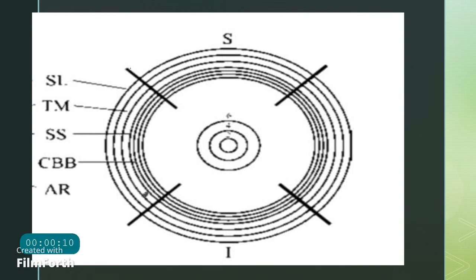So here, as you can see, these four lines represent the mirrors in which we are going to see the structure. As we know, the superior mirror is going to show the inferior angle, so whatever you see in the superior mirror, you have to represent in the inferior angle. Whatever you see in the inferior mirror, you have to represent in the superior angle. So this is how the goniogram is going to be drawn.